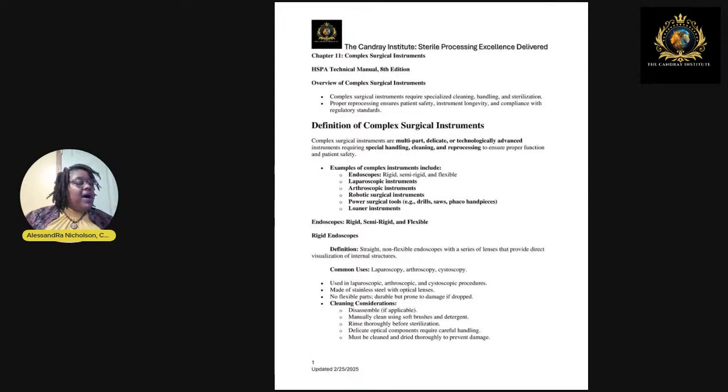All right, so let's talk about specific instrumentation. We're going to take a look at rigid endoscopes first. I appreciate you liking the live.